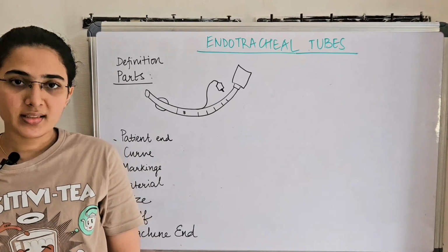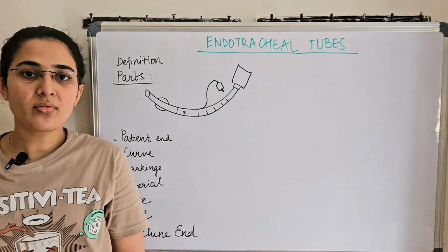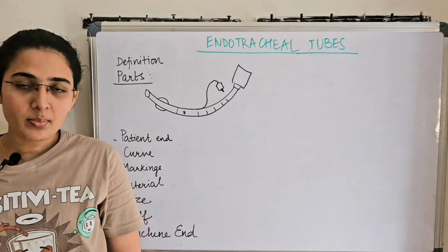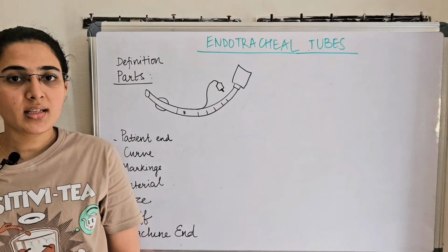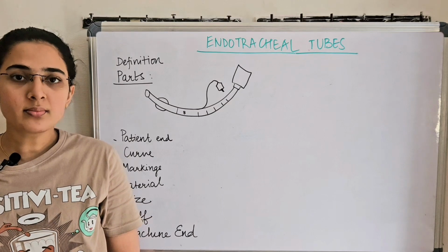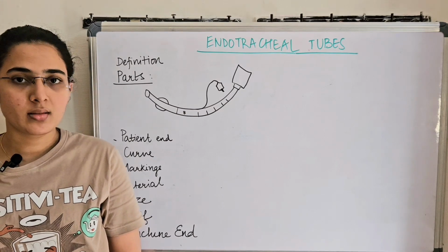This video will be discussing what is an endotracheal tube, the various parts of an endotracheal tube, the techniques of insertion, its complications, and also various confirmatory tests for confirming the presence of the endotracheal tube, and in brief regarding some special types of tubes.